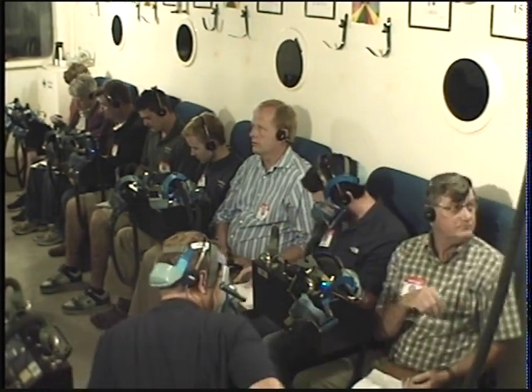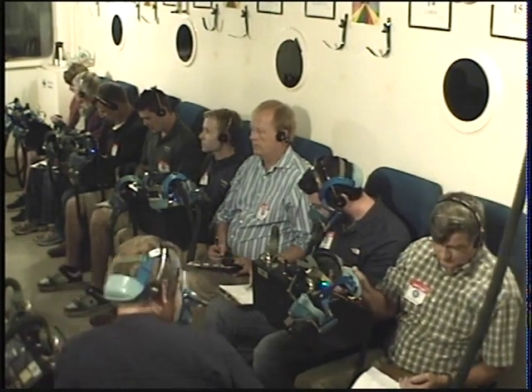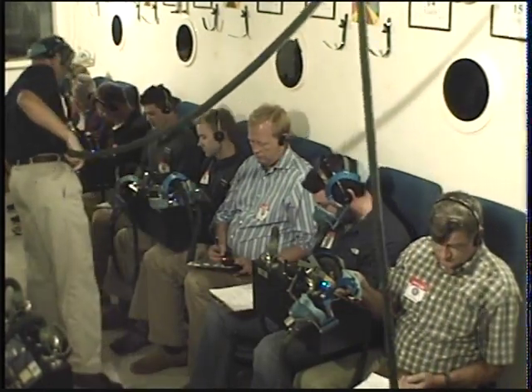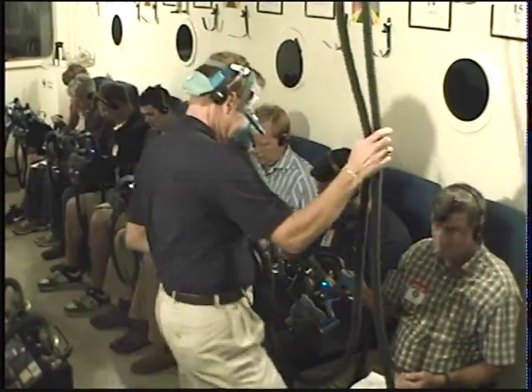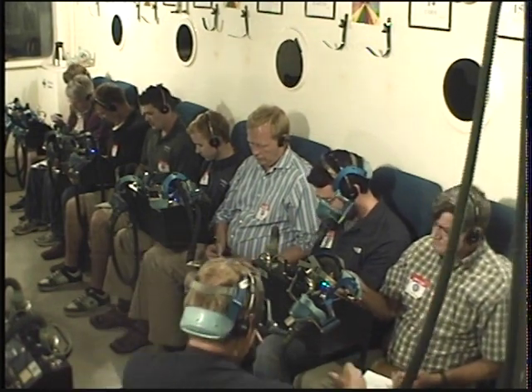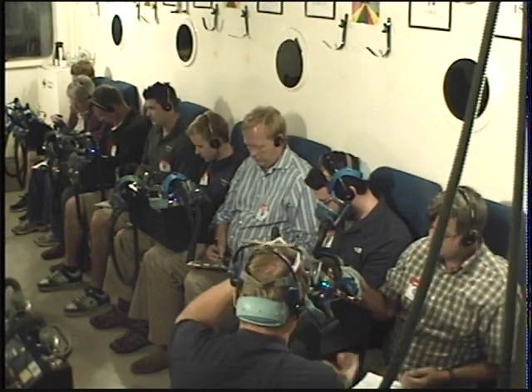Do we have any good candidates to kind of play around with? Anybody in the low 60s on their pulse oximeter? Raise your hand. All right, we are coming up on 3 minutes, so before we do that, everyone that is off oxygen, go to item number 4, 3-minute column, and put a check mark by any symptoms that you're experiencing at this point. You also need to take a pulse oximeter reading.